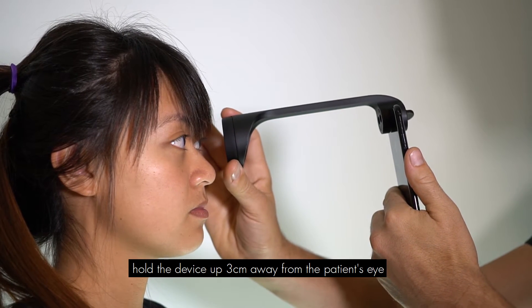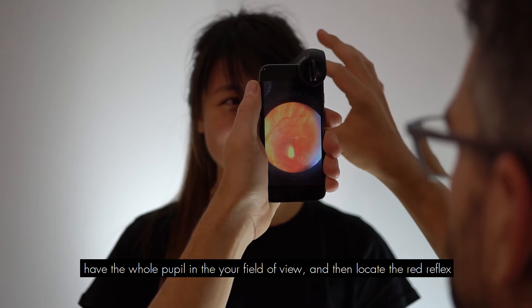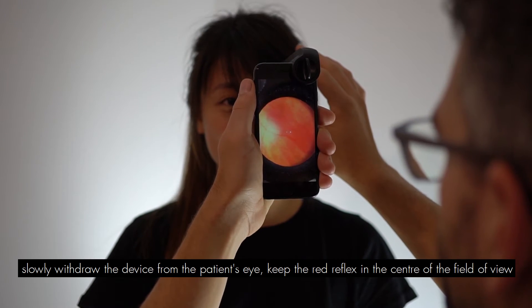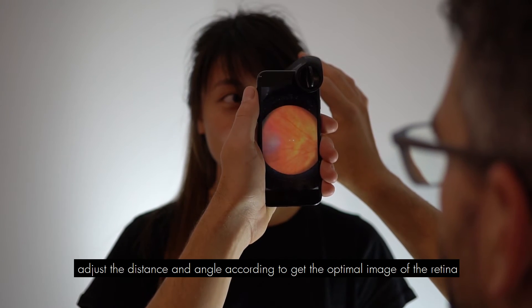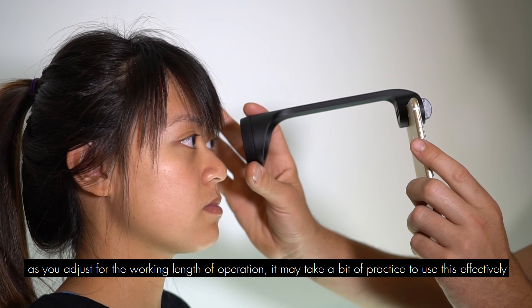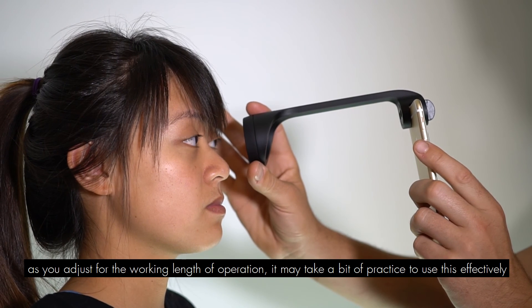Hold the device under three centimeters away from the patient's eye. Have the whole pupil in your field of view and then locate the red reflex. Slowly withdraw the device away from the patient's eye, keeping the red reflex in the central field of view. Adjust the distance accordingly to get the optimal image of the retina. As you adjust for the working length of operation, it may take a bit of practice to use this effectively.